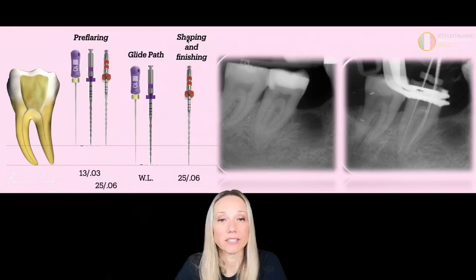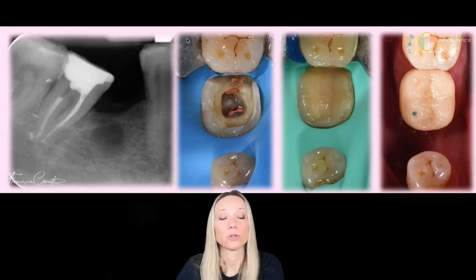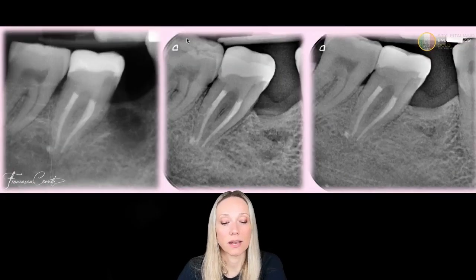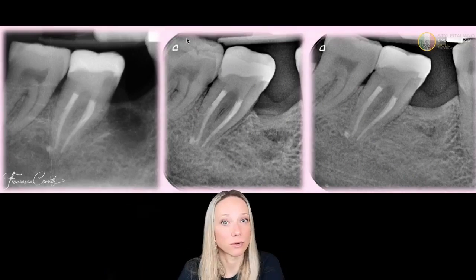Here we have the same situation in a molar, in a lower 7, that I had to treat because the patient was in pain. So I open my access cavity, remove all of the existing restoration, go with my pre-flaring first, then to the working length with manual files, and then to the working length with all of my sequence. And you see, it's a regular molar, with a lateral canal also in the middle third, that if you look close, you see is departing from the distal root.